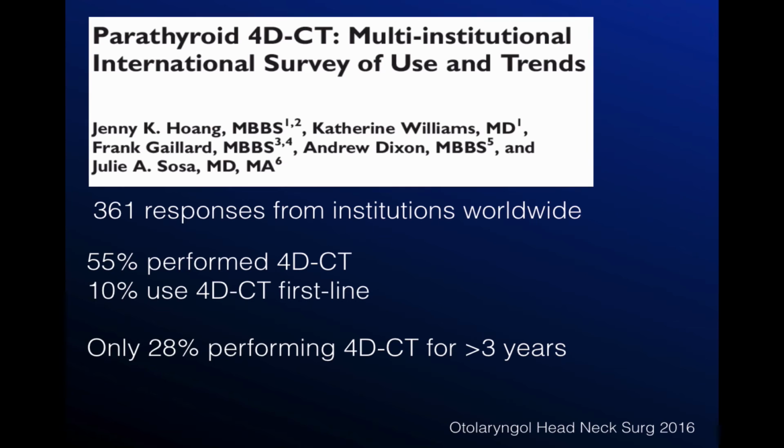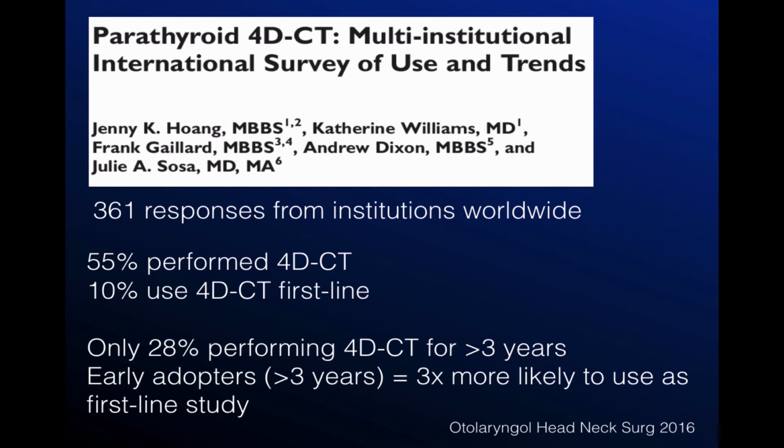So this is a relatively new imaging modality, and there's a lot of experience to be gained from both the patient, surgeon, and radiologist perspective. And early adopters, those that have been performing it for more than 3 years, were 3 times more likely to use it as an imaging study, first line. So I think this speaks to future trends in the use of 4D-CT compared to scintigraphy. As surgeons gain more experience in seeing this modality, they are probably more likely to order it as a first-line study.